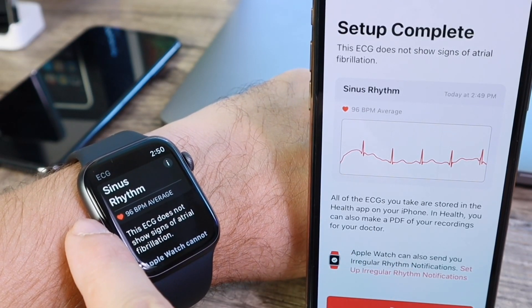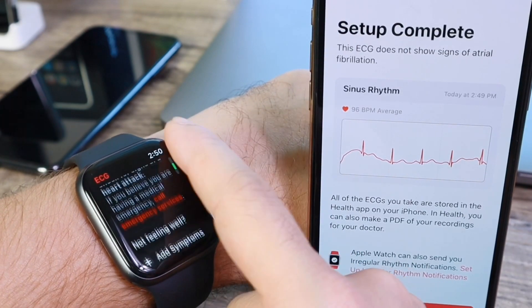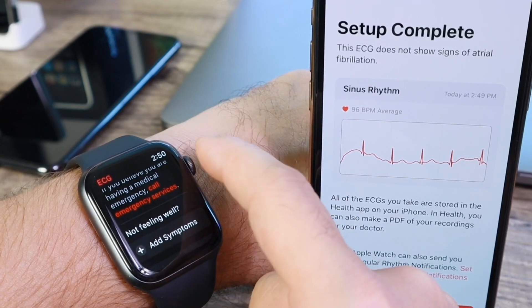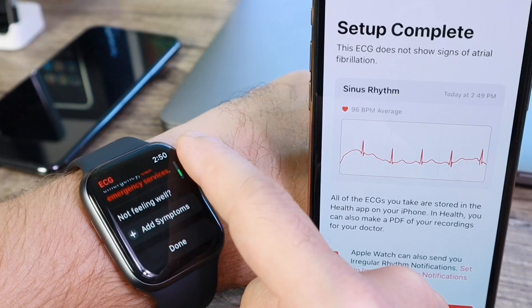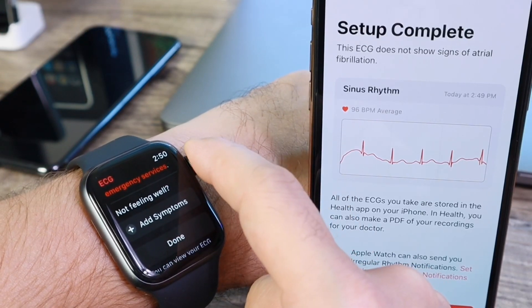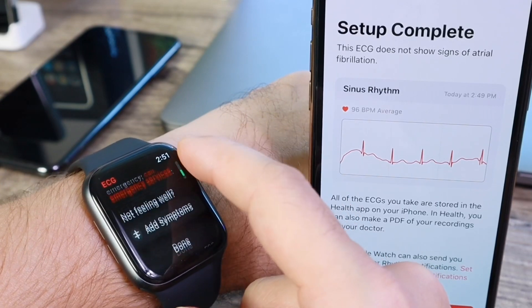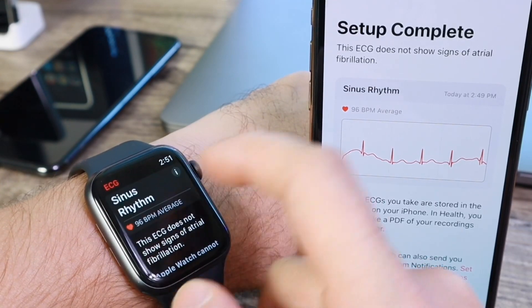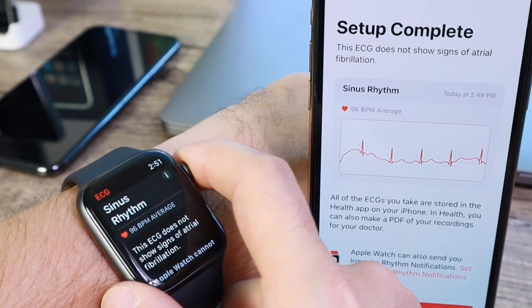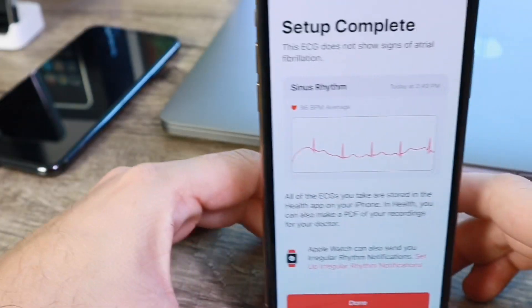My heart rate at this point was 96, which is average for a resting heart rate. There's also emergency contact information right here — if you need to call emergency services. You can also add symptoms if you're not feeling well, so you can keep track of what happens and when. That was my first Apple Watch ECG, live on video.